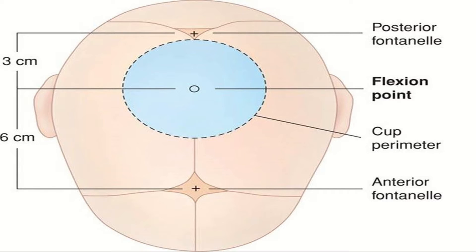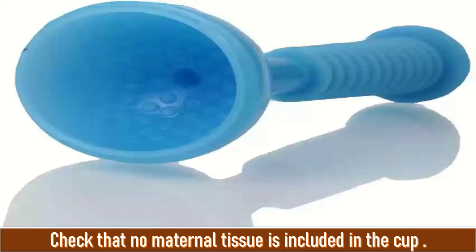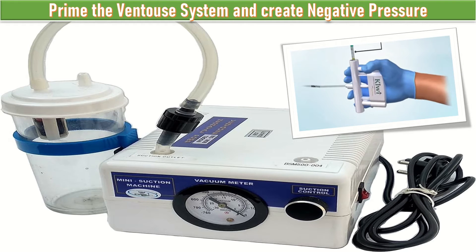I will apply povidone iodine solution on the silicone cup, fold it, and introduce it into the vagina. I will apply it 3 cm anterior to the posterior fontanelle in the midline on the sagittal suture. I will check that no maternal tissue is included in the cup, then prime the system and build up the negative pressure gradually.